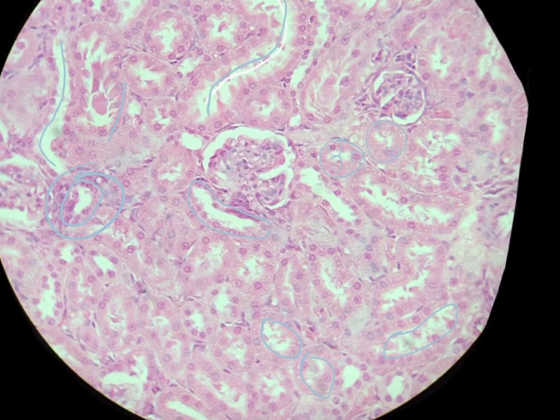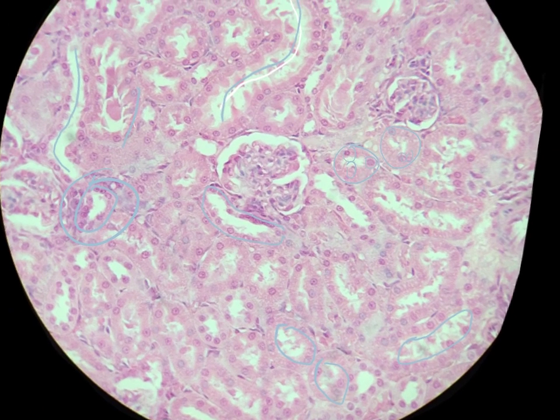Whereas in a distal convoluted tubule, the cells are actually smaller. So when you cut it, you're probably going to cut through the nucleus in every single cell that you see. And so that's one way to interpret and to guess basically what the size of a cell is: if you see all the nuclei, that means every single time you cut through those cells of the distal convoluted tubule, you actually hit the nucleus. And that's because the cell itself is smaller and the chances of you cutting through the nucleus are greater. Whereas if it's a big giant cell, meaning it has a lot more cytoplasm, the chances of you cutting directly through the nucleus go down as the amount of cytoplasm goes up.